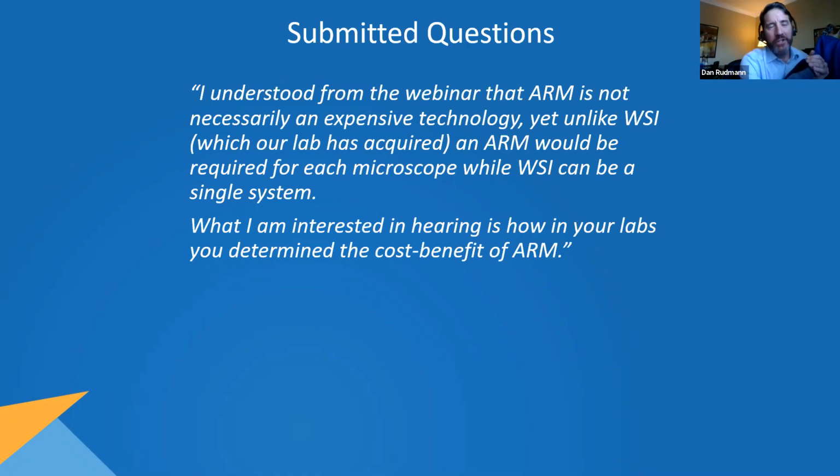And for us to expect all pathologists around the world to go from what we've been trained on and what we're used to using, we like to feel with a microscope and the focus rings and all that, to go to all WSI and AI and be effective and efficient and even just accept it is probably a pretty big objective.